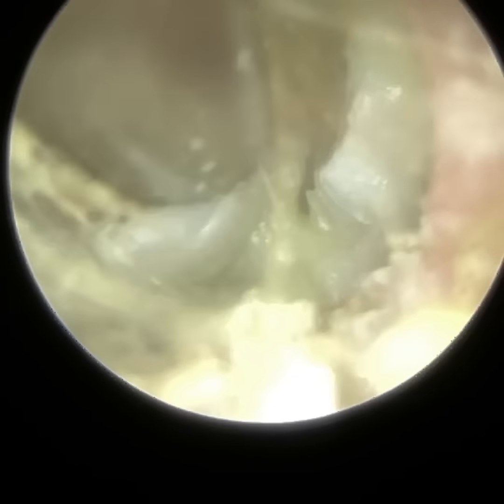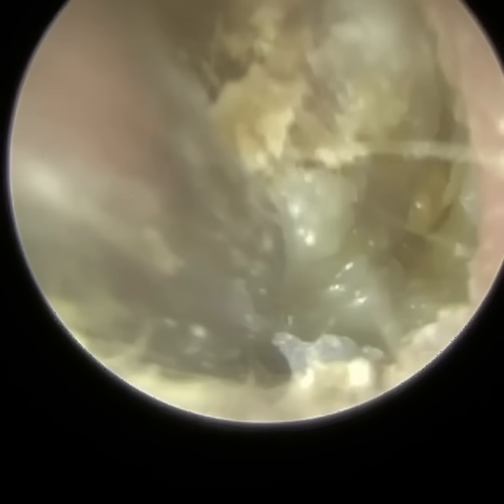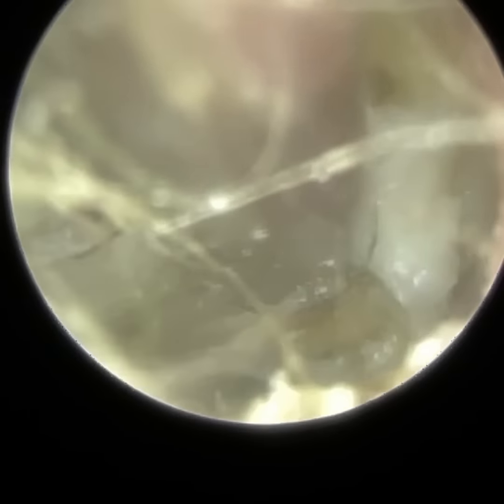They are an elderly patient, which means their skin is naturally drier. That's because you just don't produce the same amount of sebum, which is an oily lipid secretion that helps to moisturize the skin, and also an oily sweat that's formed in the ear. So the skin that lines the ear canal is void of these natural moisturizers. Also, as we get older, we have less collagen in the dermis layer. When you have less collagen, the skin becomes a bit more bumpy, and when it becomes bumpy at the surface, it's harder for dead skin to naturally migrate. So you get this shedding of skin that then collects in the ear.